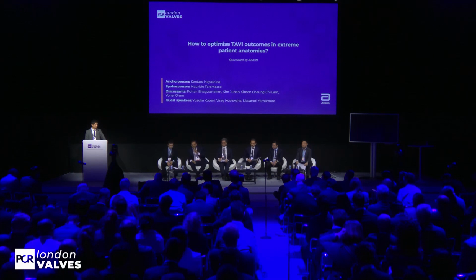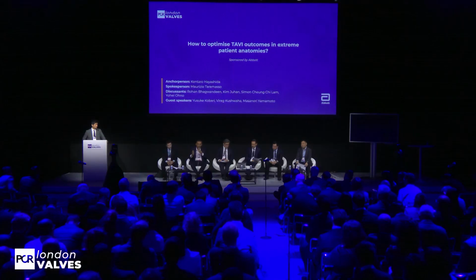Exactly. So I would like to ask a question of Rohan. What do you think of the impact of leaflet overhanging in TAV-in-TAV procedures? Thanks, Kentaro. In the couple of cases that we've had, it's important to understand the mechanism of the valve failure. In some instances, it's actually a frozen leaflet. I don't think we have all the data that we want, but we want to avoid it as much as possible.